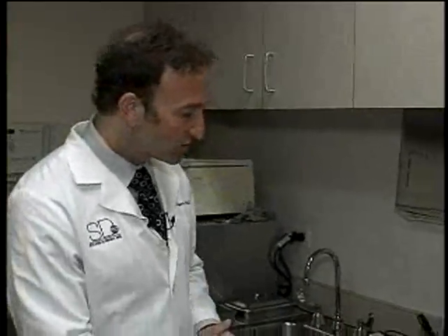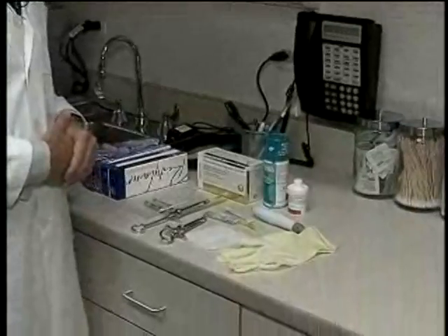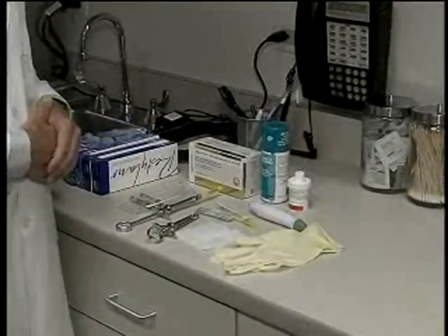To start, I'm going to show you how we go about preparing to treat the patient by first looking at the products that we use for anesthetizing the patient and getting them all ready to go, and getting the products out of the packages. So these are some of the things that we have set up when we're ready to treat our patient. These are already prepared in the room.